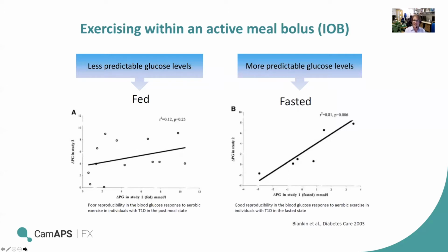Okay, we've put this in here. It's a really, like we said earlier, or what James would also talk about, is one of the most useful tips that we have for people that are interested in getting active or doing exercise on insulin: trying to minimize the amount of active insulin on board.